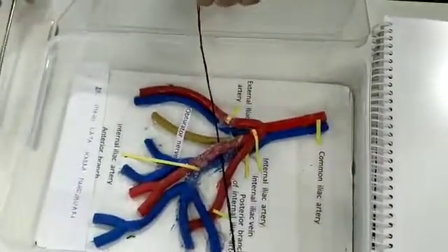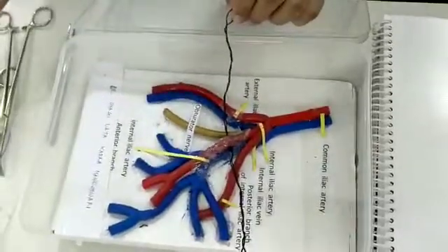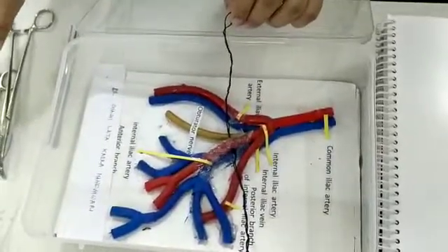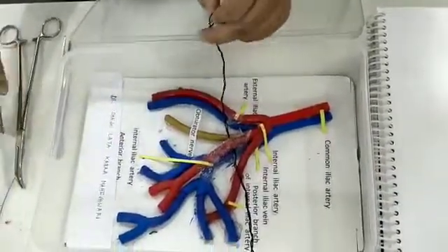This gives me a chance of making two ligature sutures only by passing below the artery one time. This prevents the chances of injury to other vital structures.